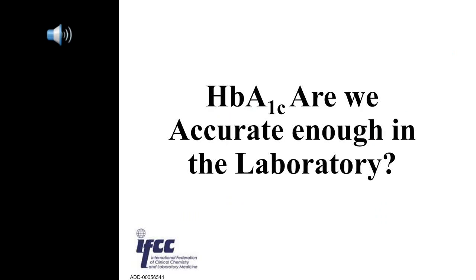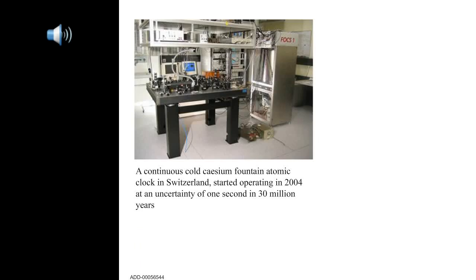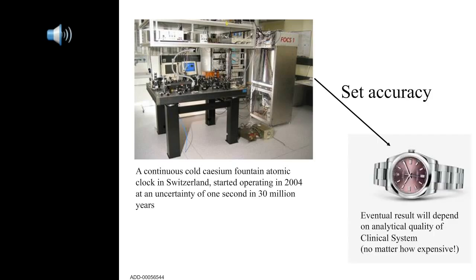So, are the methods that we use in a laboratory accurate enough? Well, I think of it this way. We now have the IFCC reference measurement procedure for standardization, and we can look at this as an atomic clock, accurate to 1 second in 30 million years.